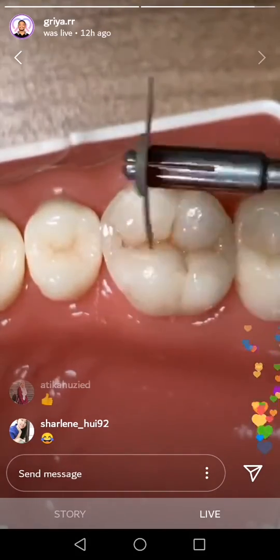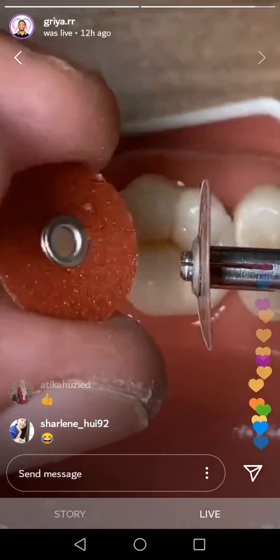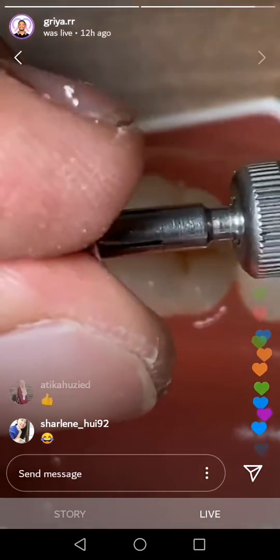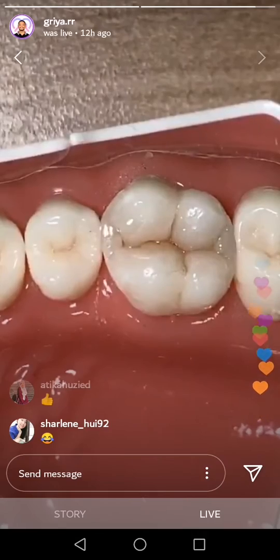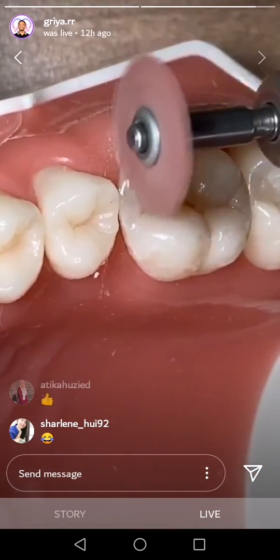Yeah, bending, and then it will be good. This is the original, still new. This is already used. Okay, so bending like this. Then we can smooth in here.